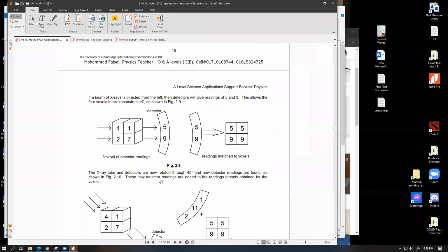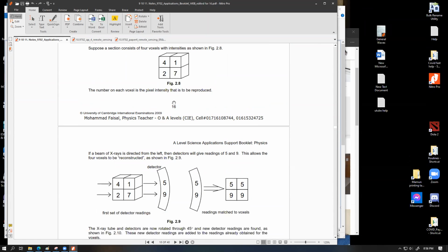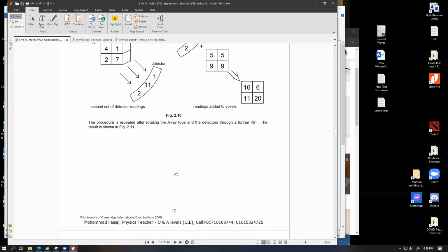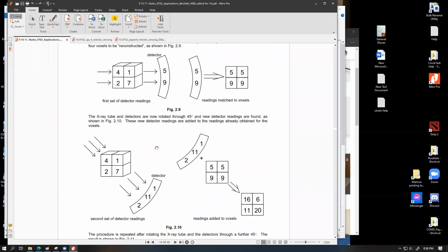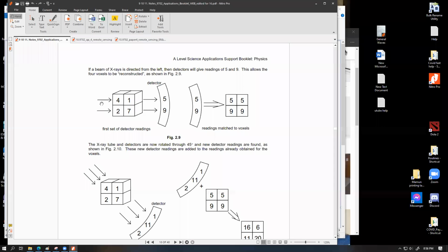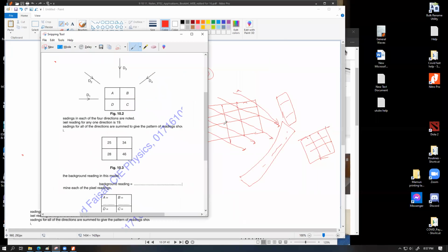Now this is the important bit. What does this mean, repeated for successive slices? You have to understand this process of scanning. These are 4 voxels which are being scanned from this side to begin with, and ultimately we get these numbers 4, 1, 2, 7. So this is along one line of the patient. What do I want you to understand? Let me take this image and try to draw a patient around that image. That's what I want to do.